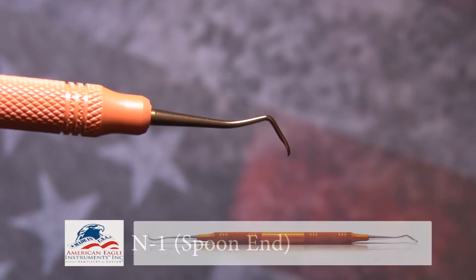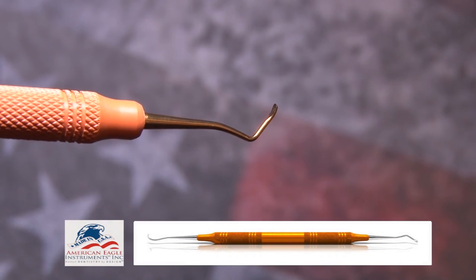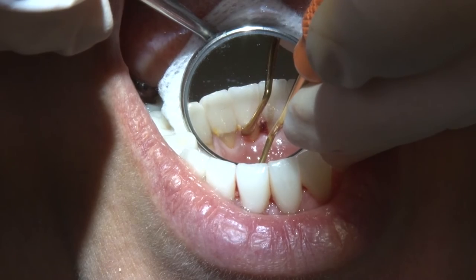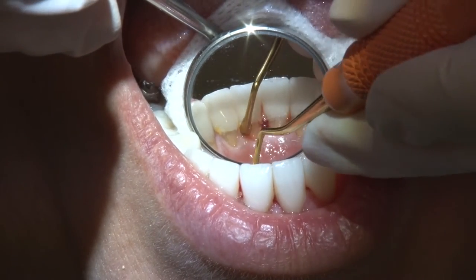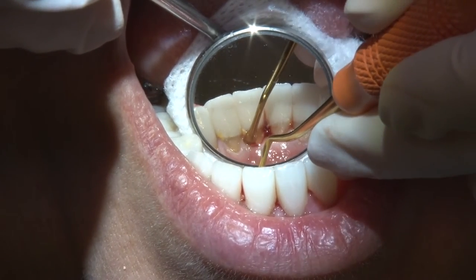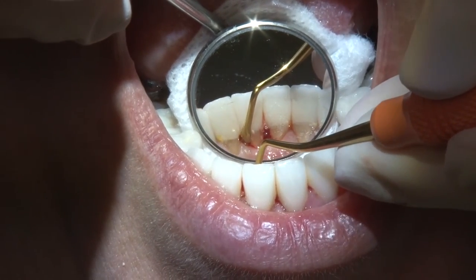The spoon of the N1 is an ideal instrument designed in sharpen-free XP technology, maintaining the oval shape for maximum effectiveness. Sharpening such a delicate working end would quickly compromise the intended shape. Sharpen-free XP technology allows the blade to maintain its original integrity and angulation throughout its lifespan, which is a great advantage to consistent patient treatment.